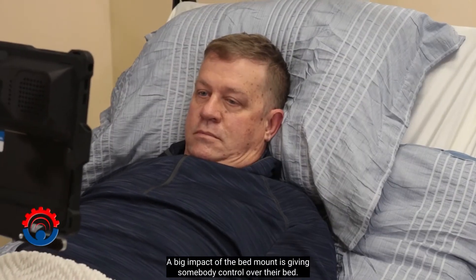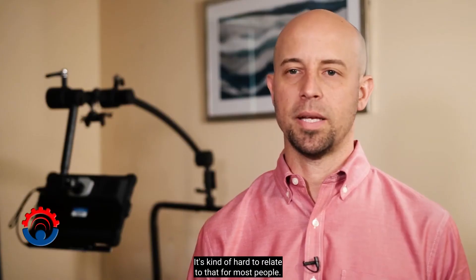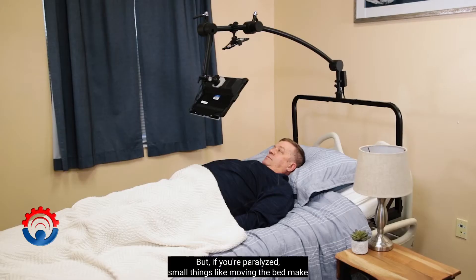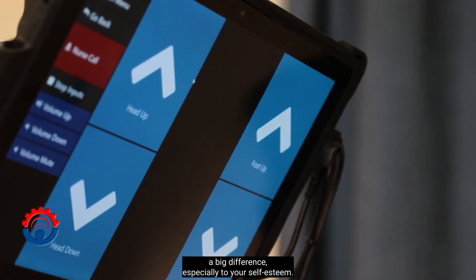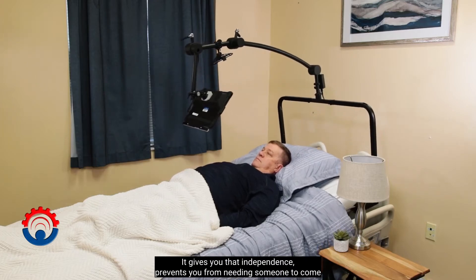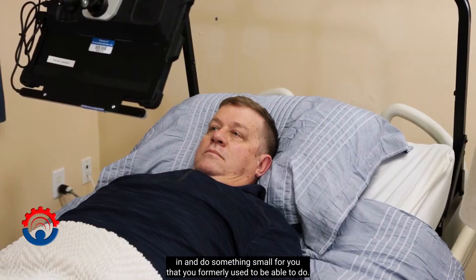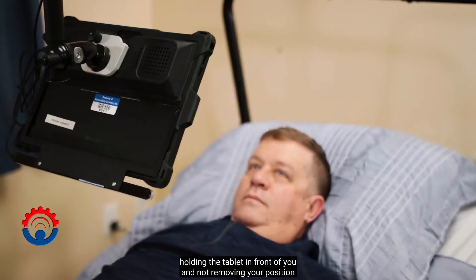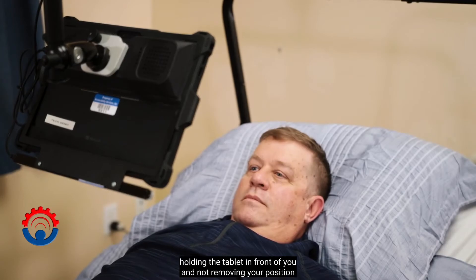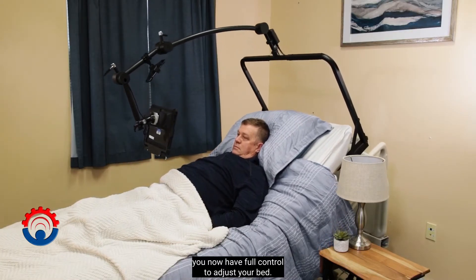A big impact of the bed mount is giving somebody control over their bed. It's kind of hard to relate to that for most people, but if you're paralyzed, small things like moving the bed make a big difference, especially to your self-esteem. It gives you that independence and prevents you from needing someone to come in and do something small for you that you formerly used to be able to do. With the new bed mount, holding the tablet in front of you and not removing your position, you now have full control to adjust your bed.